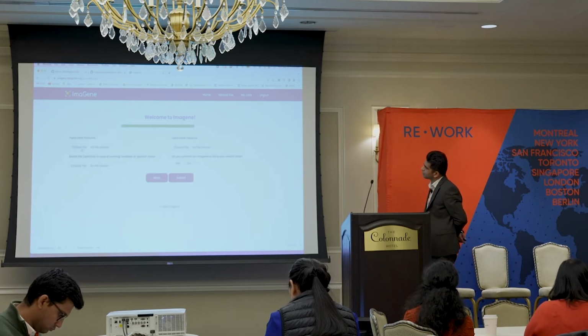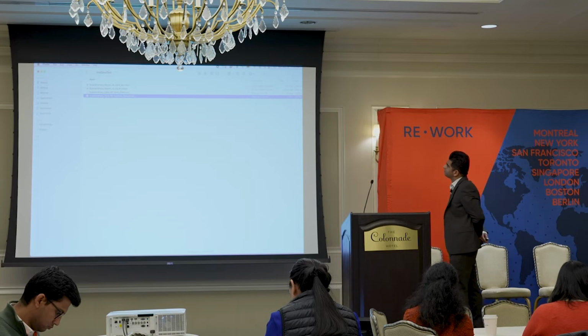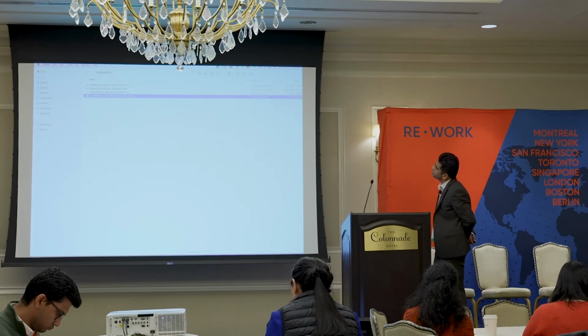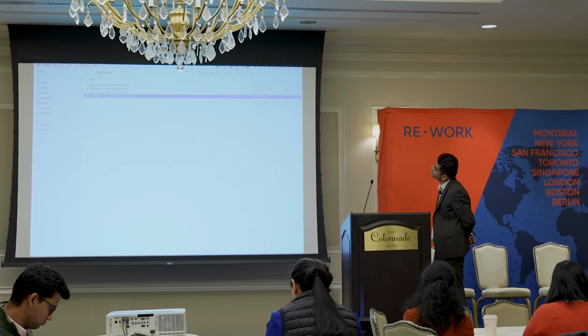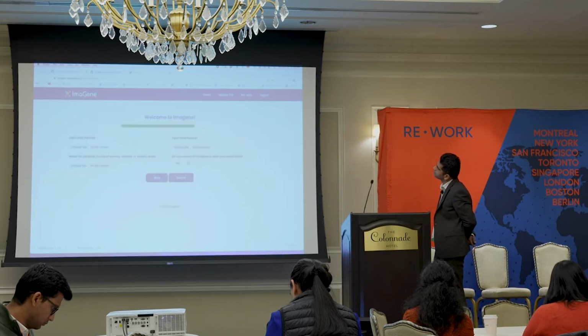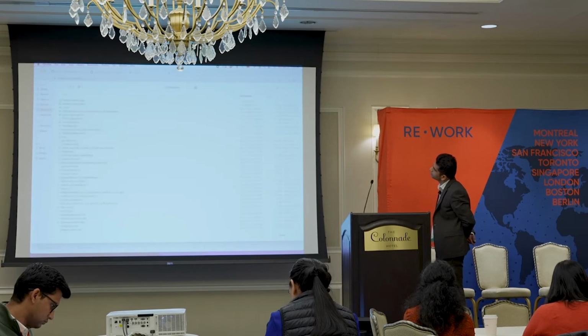Next, we input data and label features here. One thing to keep in mind is that your input file name should have underscores or hyphens, preferably underscores, and should not contain any spaces in them, such that the software could intake them appropriately and operate through to get you definitive results.